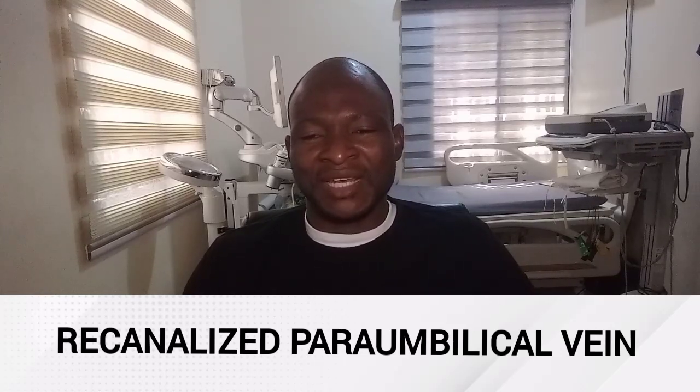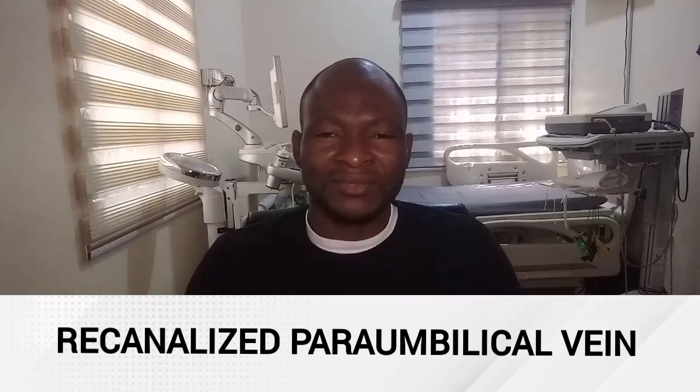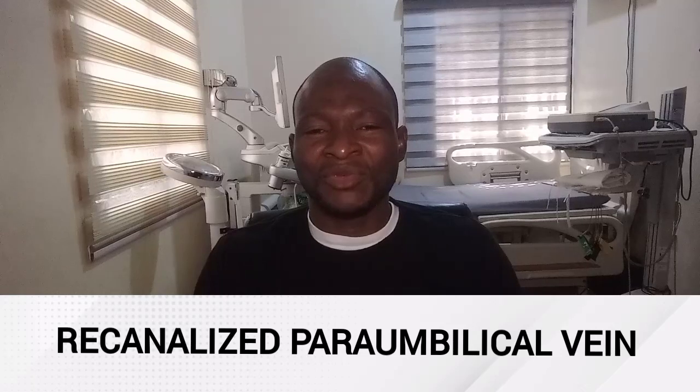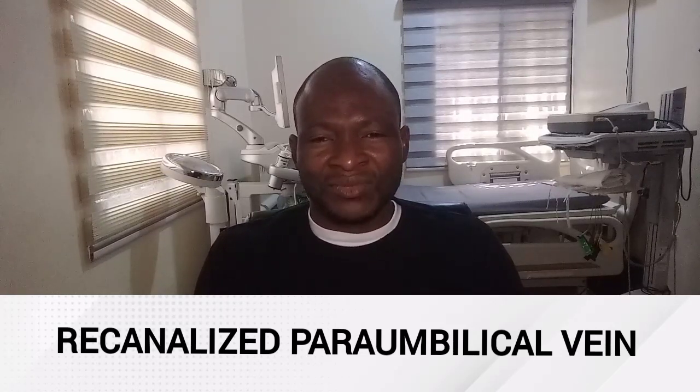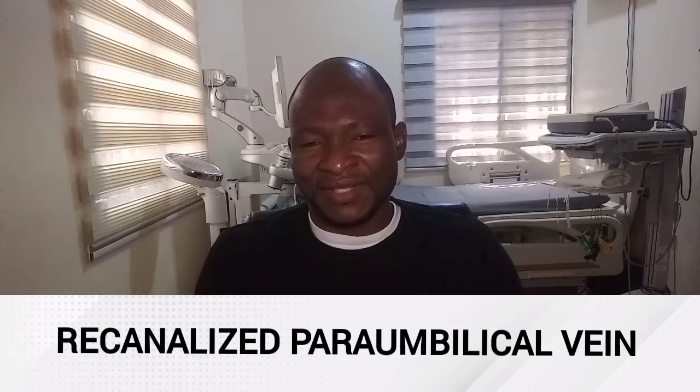Its origin from the left portal vein is followed posterior to the anterior abdominal wall, and it terminates near the umbilicus. They are best seen on longitudinal view. Clinically, it can be seen in the anterior abdominal wall as caput medusae. In portal hypertension, color Doppler sonography will show hepatofugal flow within the dilated paraumbilical vein.